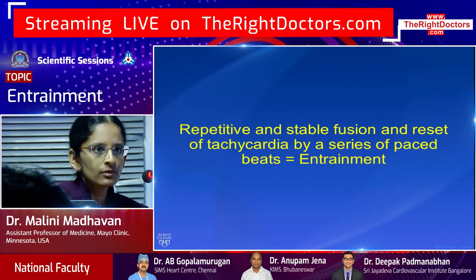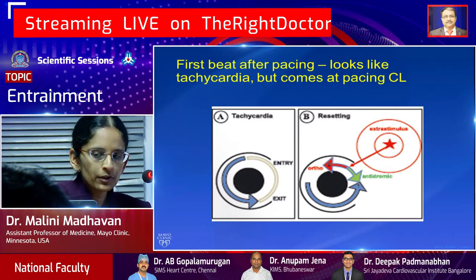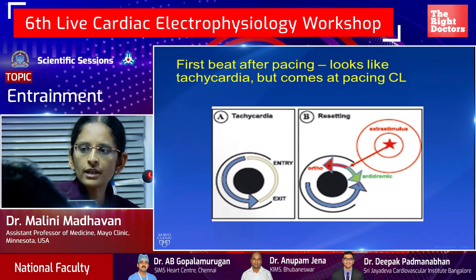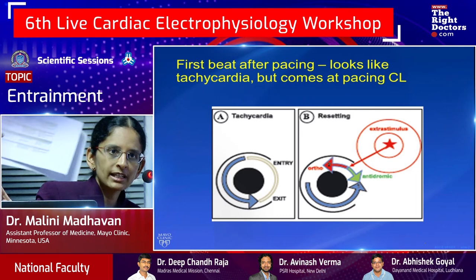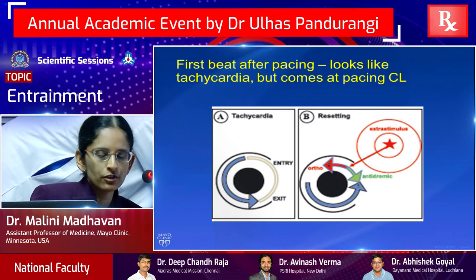And the same principles apply. And you can take it one more step further. So we talked about fusion, we talked about reset, progressive fusion, but if you're delivering a series of stimuli, you can also look at what happens after the last stimulus is delivered. Okay, so that's the third criteria for entrainment.